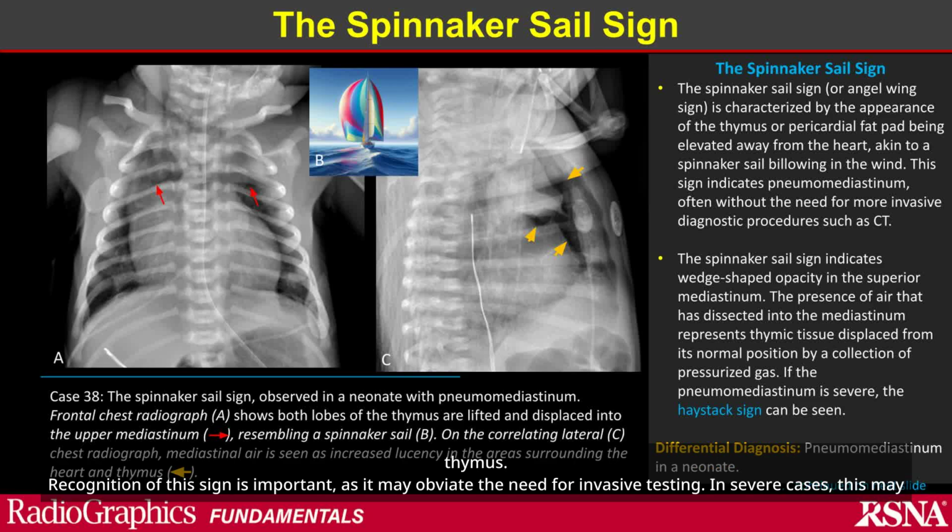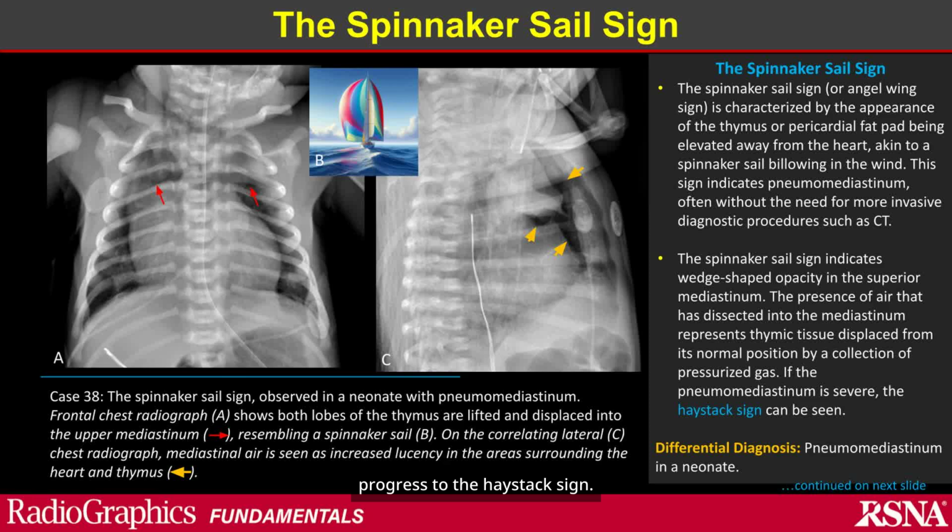Recognition of this sign is important, as it may obviate the need for invasive testing. In severe cases, this may progress to the haystack sign.